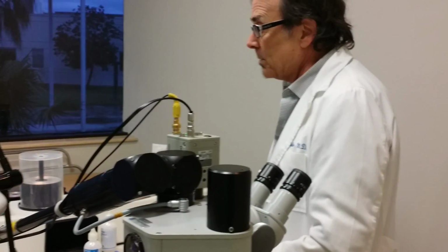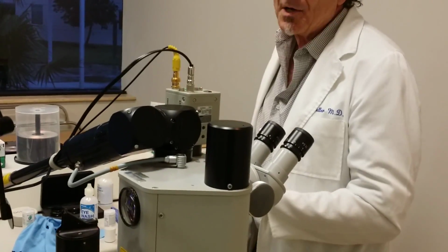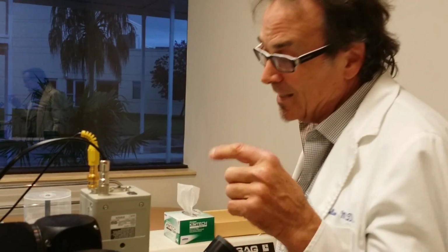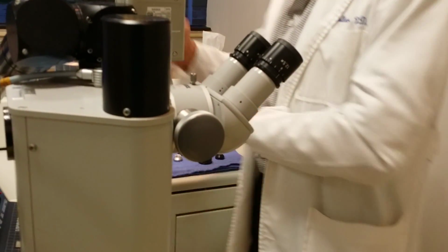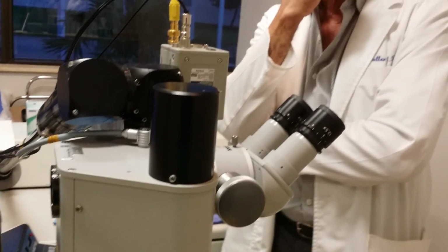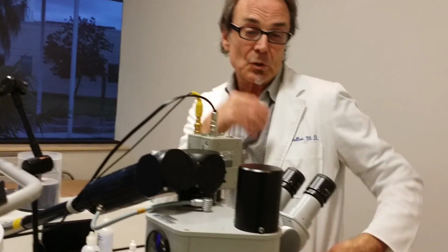The 5% that have a problem with it, whether it's a visual problem or a work problem, or they're monocular, they have one good eye. If they have one good eye and they have an opacity, then it's very disabling for them. And I only go ahead if I think I can do it. The reason I can do it is because I'm fortunate to have a machine that was made in Switzerland for the express purpose of doing vitreous laser surgery.